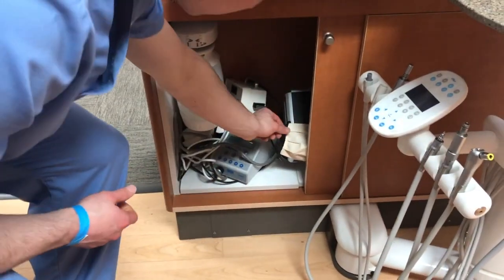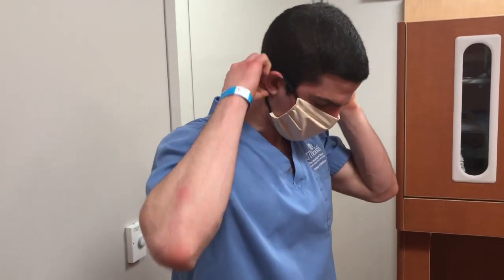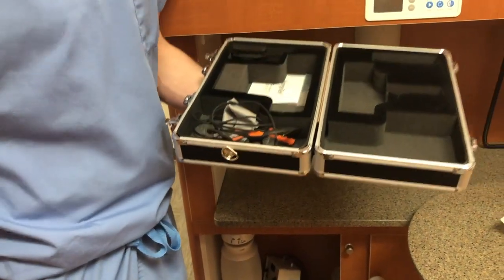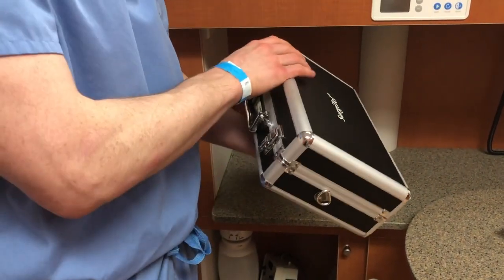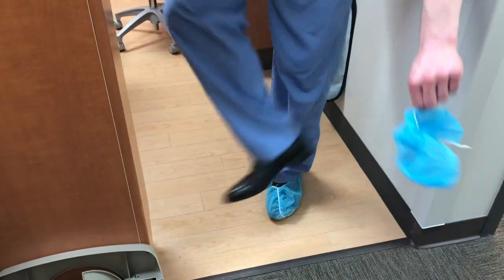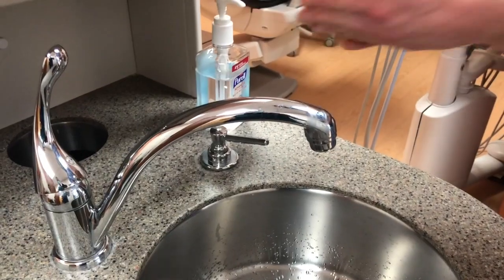You can now retrieve your belongings from the cabinet, including your daily mask, which you should put back on. Remove your shoe covers, discard them, and perform hand hygiene one more time before leaving the clinical area.